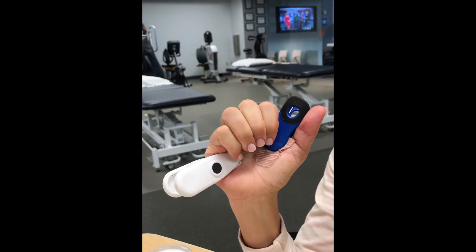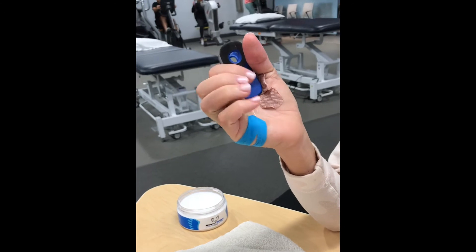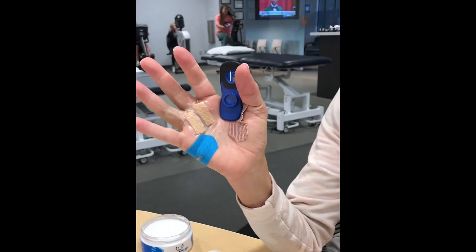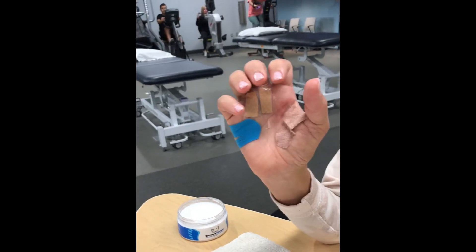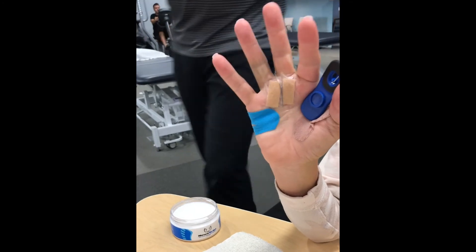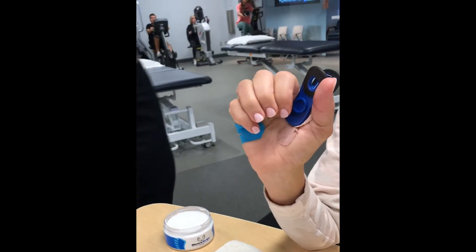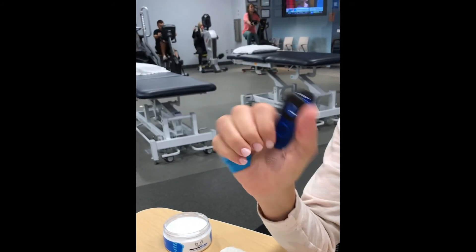It's kind of awesome. Weird. Swollen. So now they feel less swollen — yes, they don't feel swollen with this on. Here it feels completely too swollen to close. And then put it back on — oh my god, I'm in love with it too. Look at the range of motion differences in the face. It's so crazy. It just feels like it took the swelling out.